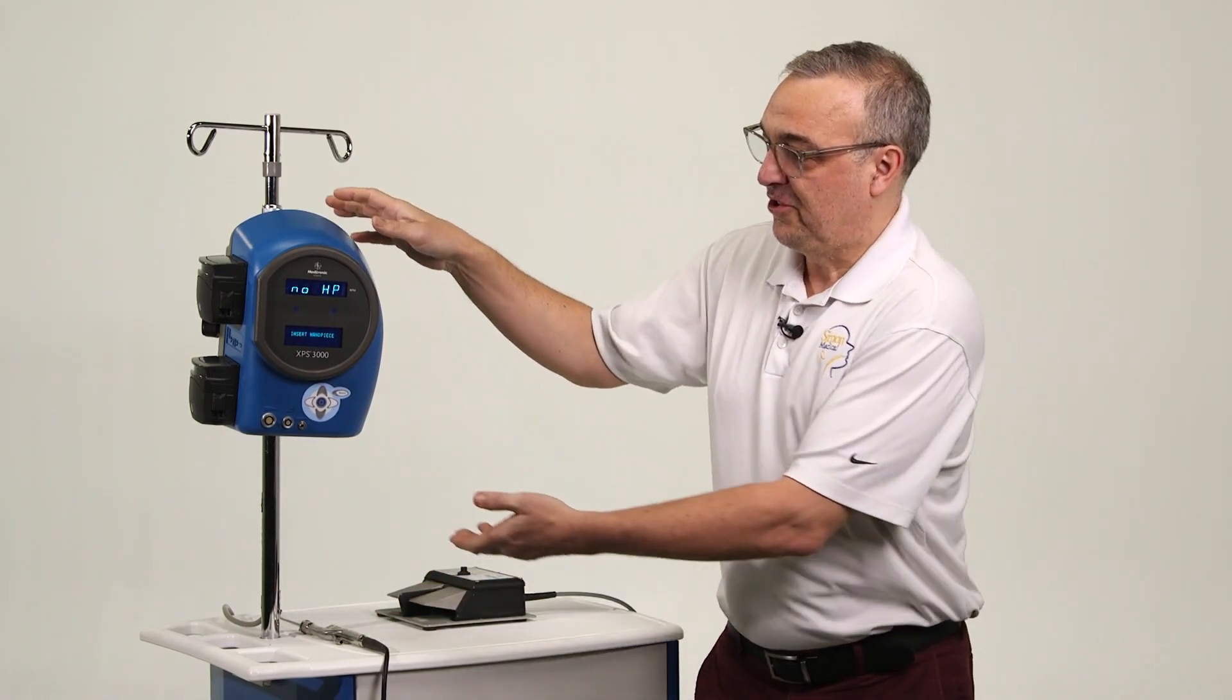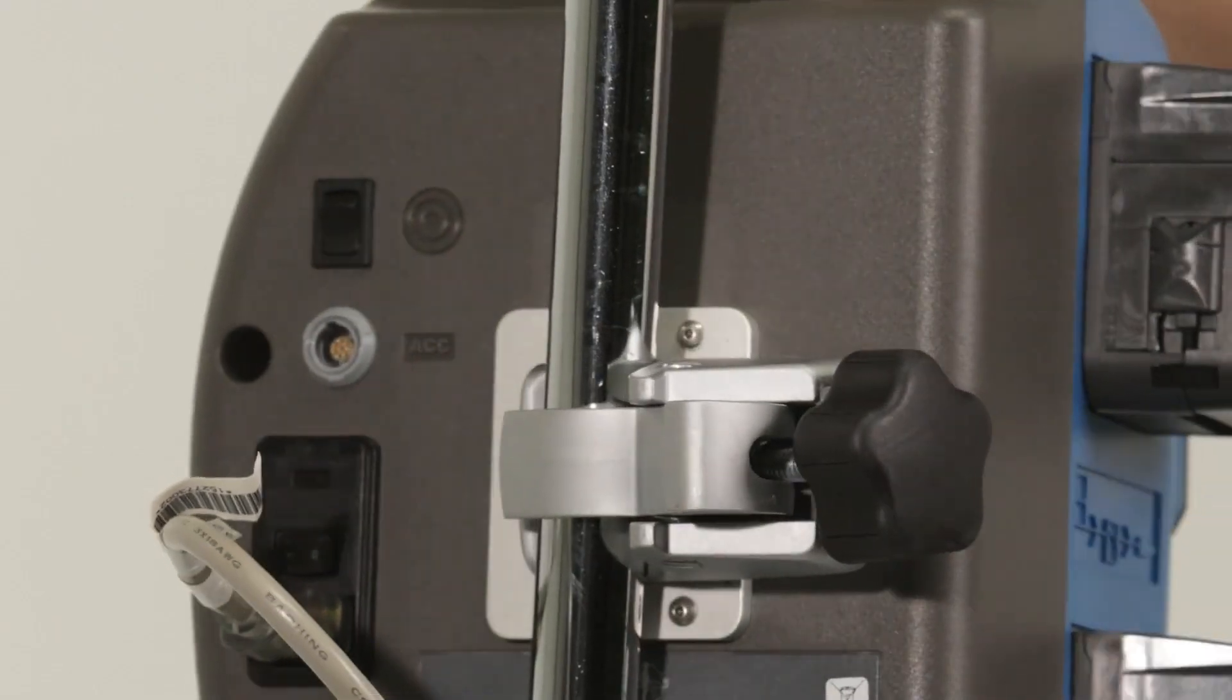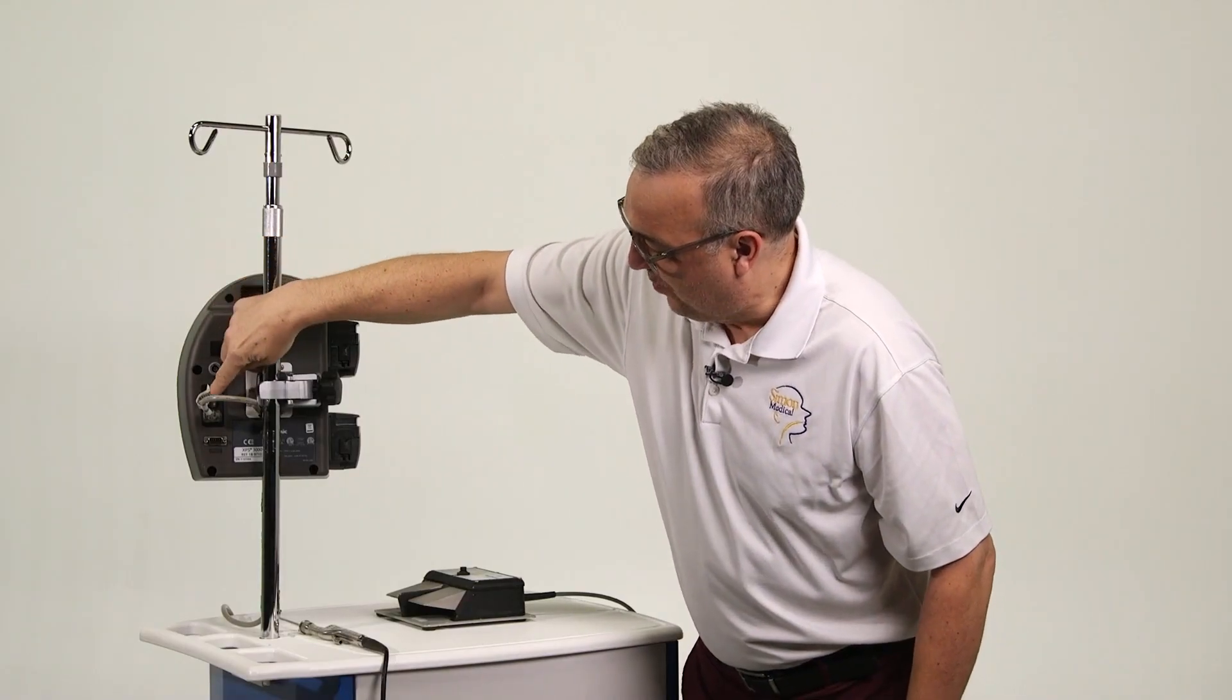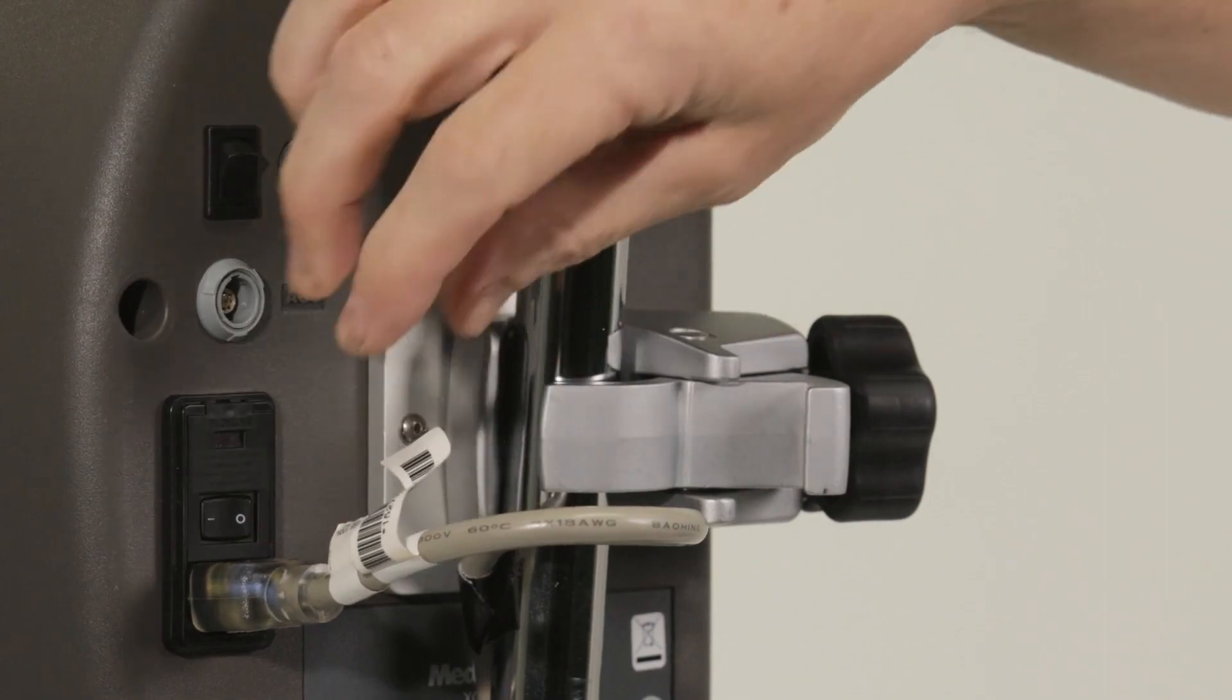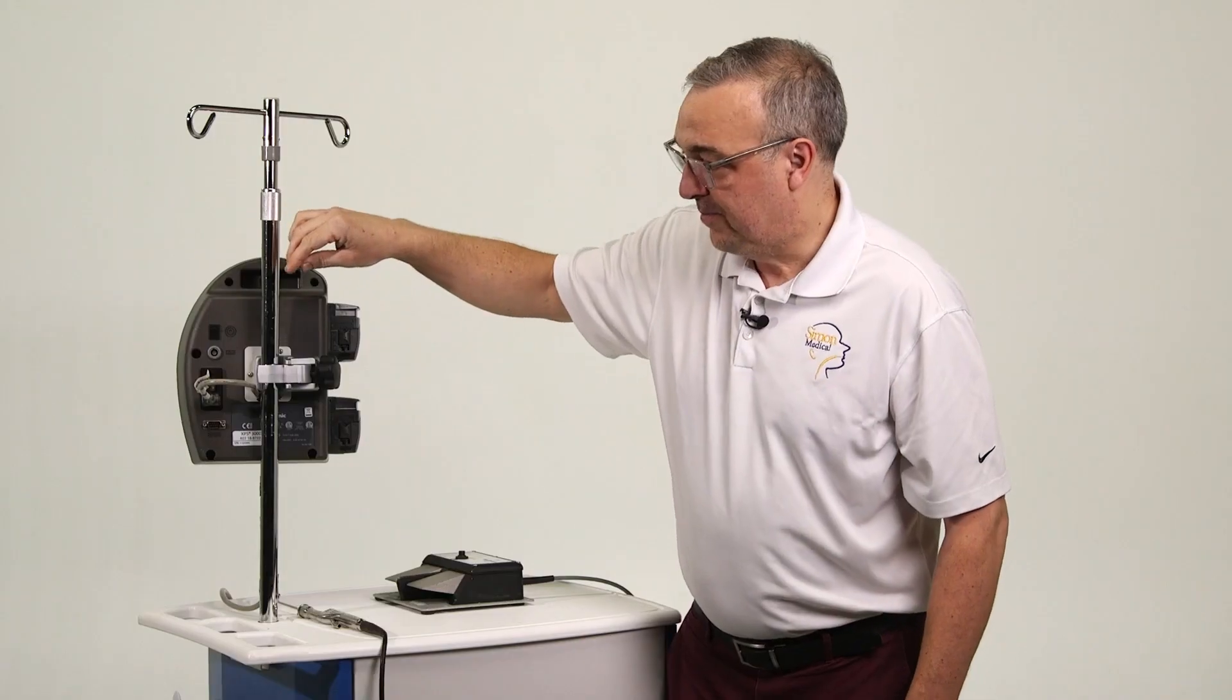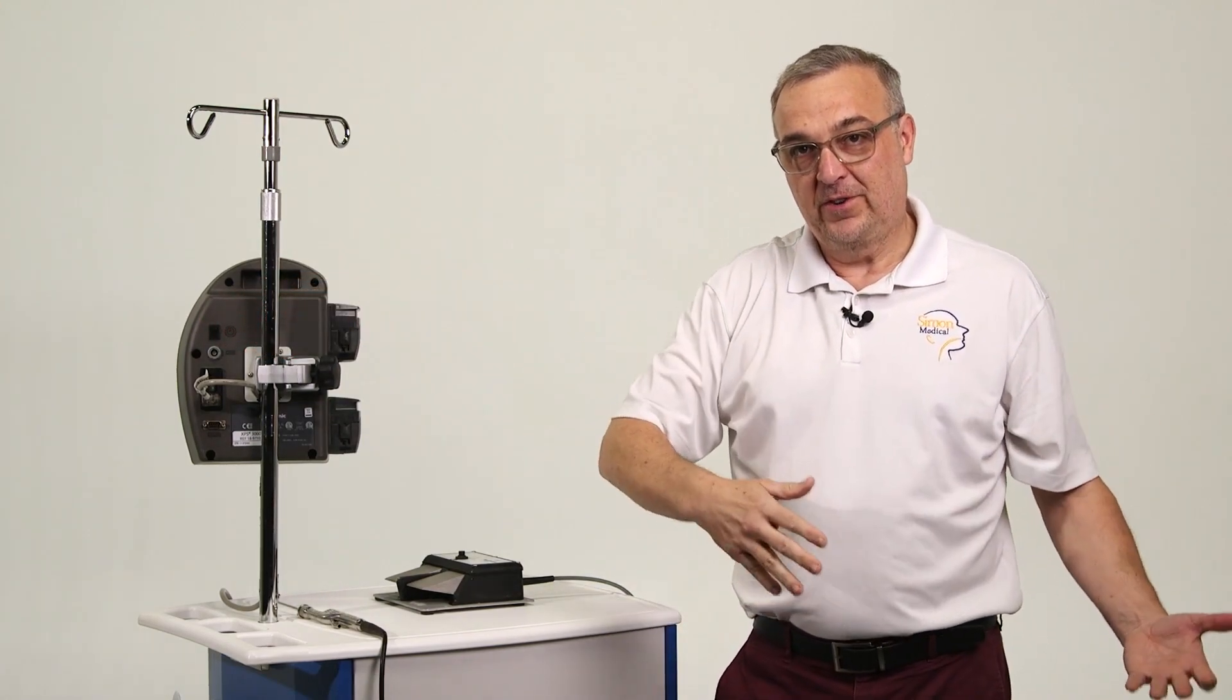So I'm going to briefly turn the unit just to show you the back. When the XPS is mounted on an IV pole, you'll see on the back we've got the power button on, we've got the cord, the power cord in. So you'll need to have that obviously with you when you're taking this from storage to the OR.